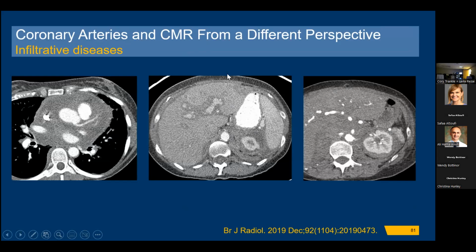There is an image of the abdomen here. We have the same abnormal infiltration within the liver around the portal veins. And interestingly, we have a lot of infiltration around the kidneys, and kidneys appear to be shrunken from this infiltration of capsule, which pushes on the cortex. So this is a case of Erdheim-Chester disease.